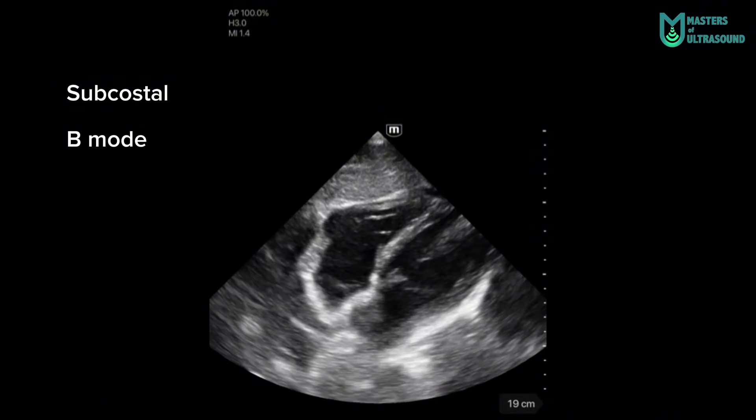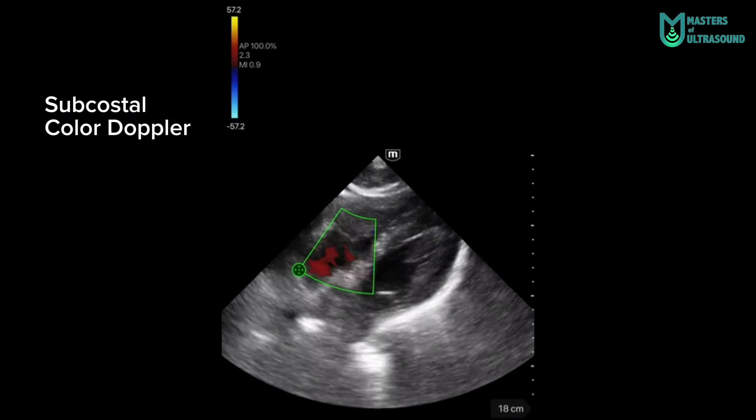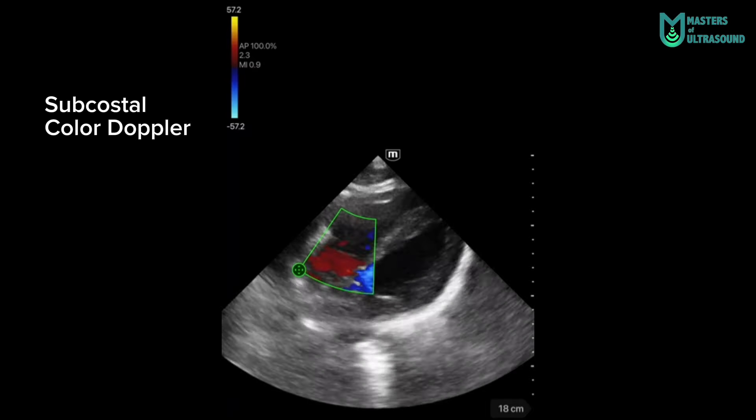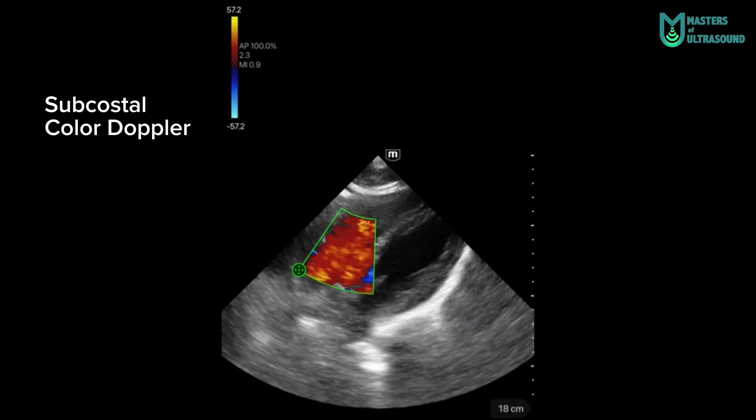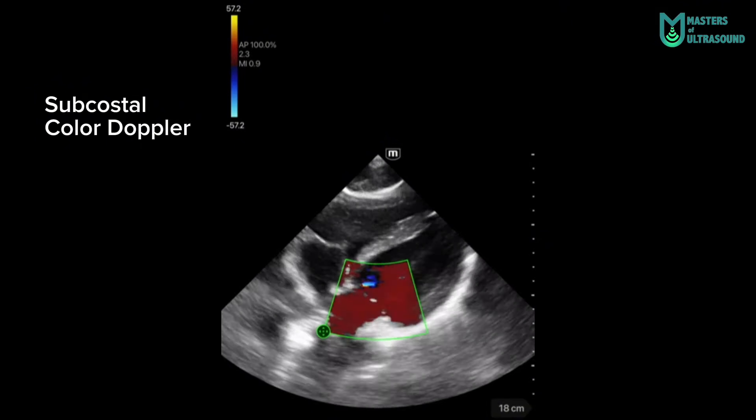Here is a subcostal B-mode image, and again with color doppler — a really sharp image with the color doppler in my humble opinion, showing both the tricuspid valve and mitral valve.